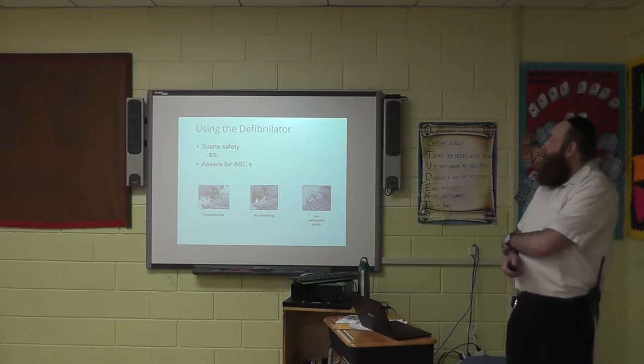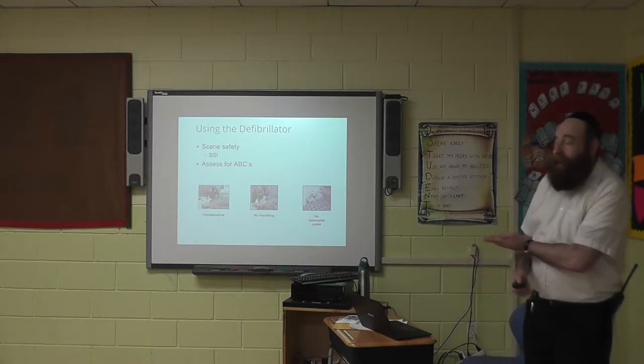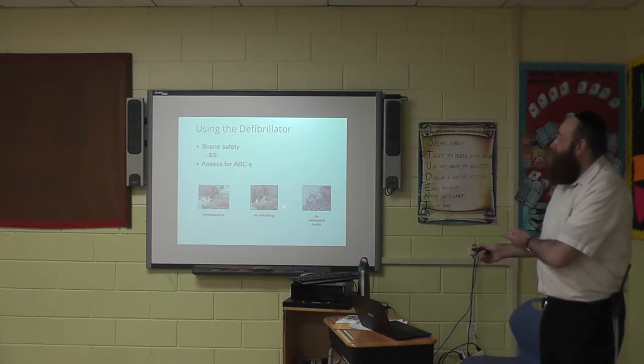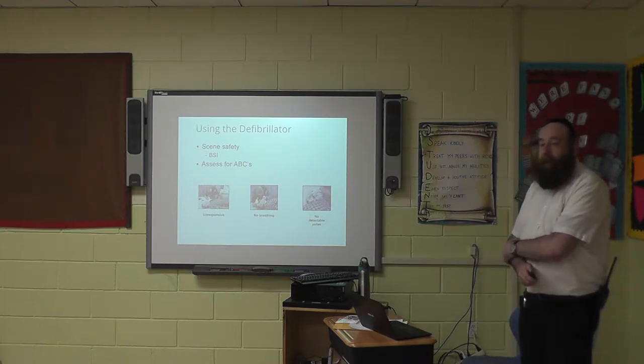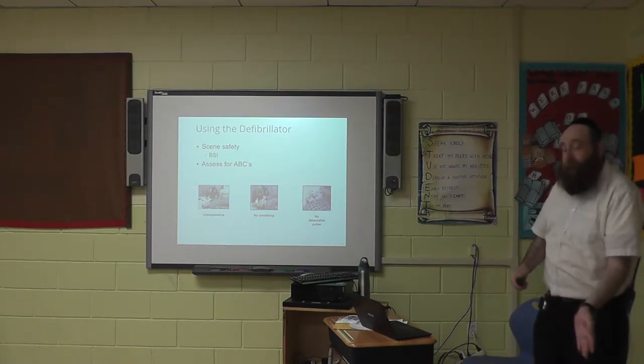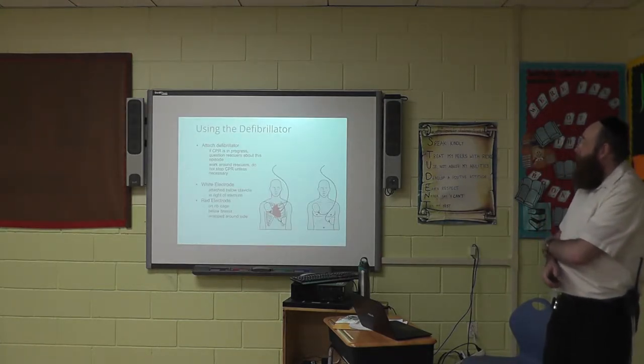Okay. Using the defibrillator, first of all, we need to check for these three things: unresponsive, apneic, and pulseless. We should know this by now. Same as CPR. Whenever you're doing CPR, you want to have a defibrillator at your side. So how do we use it?